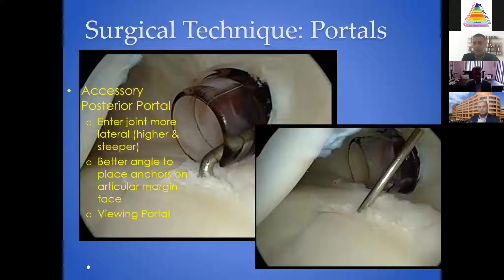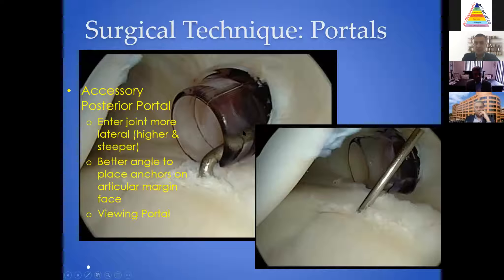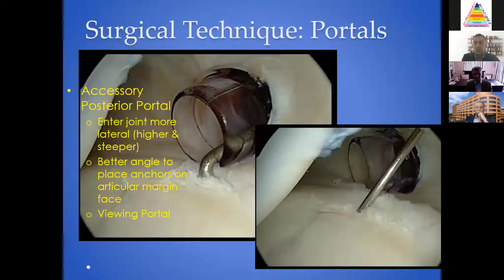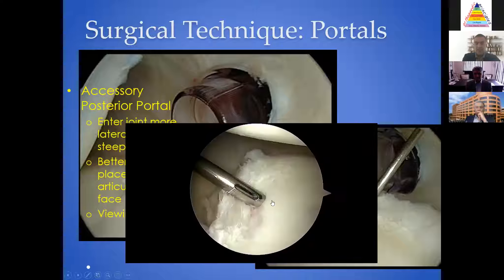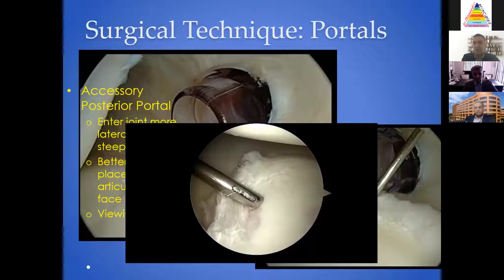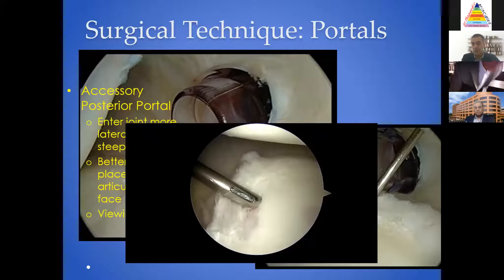Portals matter. Using the posterior portal, most surgeons think they can put in anchors from there, but if you look at the difference in trajectory of this probe versus this spinal needle, you're going to enter the glenoid in a very different fashion. There's really no worse feeling than running a drill along the glenoid and seeing the cartilage bubble below you — in five to ten years, that's going to be significant arthrosis. I want to be at an angle where I'm not going to enter the articular cartilage of the glenoid or damage it. You certainly don't want to skive, undermine, or bubble that cartilage.